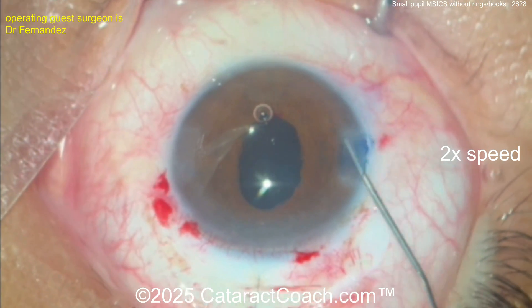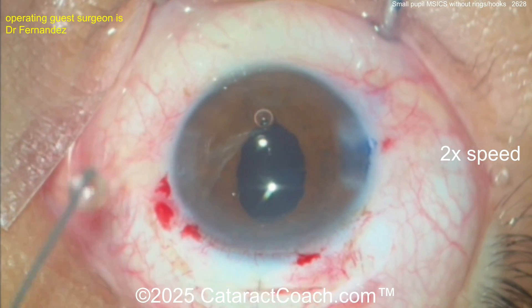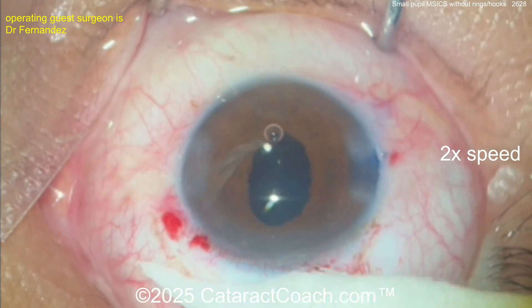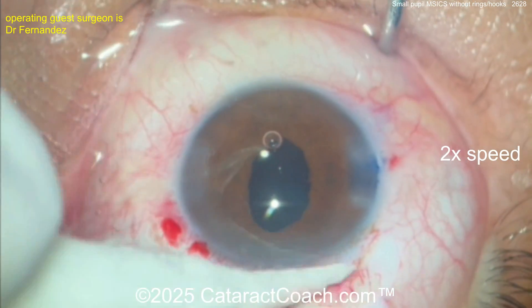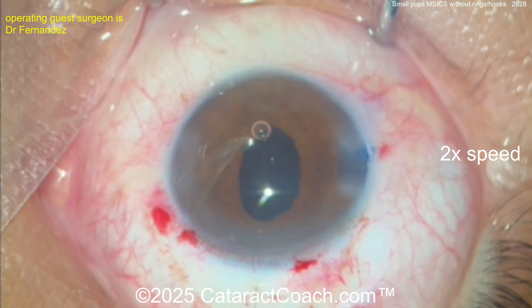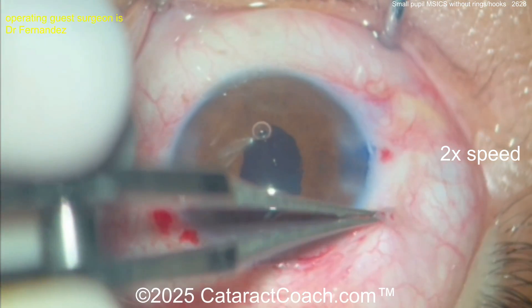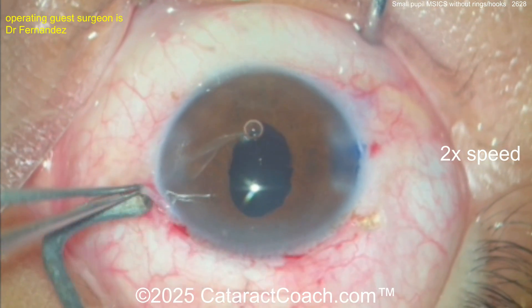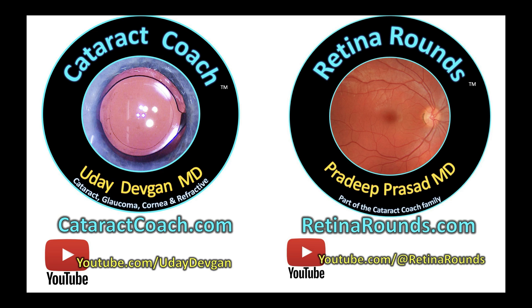Time to close the conjunctiva. I encourage you, if you have not learned MSICS because you're a bit afraid of it — that's okay, you can learn. It's a fantastic technique. Maybe for a case like this you'd say 'I would have done phaco,' and fair enough, but for a truly brunescent, dense, rock-hard cataract — even in Beverly Hills I'm doing MSICS for those cases. It really is a wonderful procedure. A little cautery here to close the conjunctiva. Nicely done.